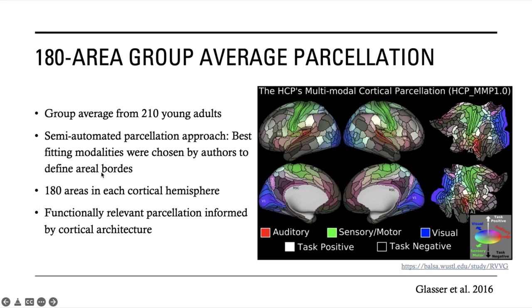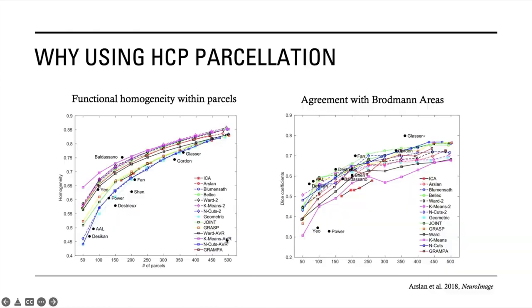And this is the cool thing, because we have now a parcellation which is functionally relevant. So we have areas that are functionally distinct, but also are informed by cortical architecture, like the folding structure and the cortical thickness and the myelin, which is the way to get a kind of cytoarchitecture, but not with the cell bodies, but with the axons or with the myelin. It's a non-invasive measure of brain architecture. So the cluster parcellation integrates different modalities and therefore it's functionally but also architecturally legit, so to say. And this can be seen here as well.